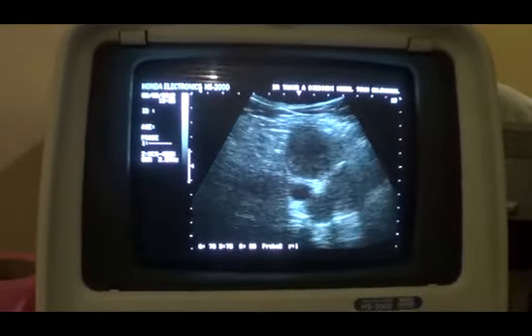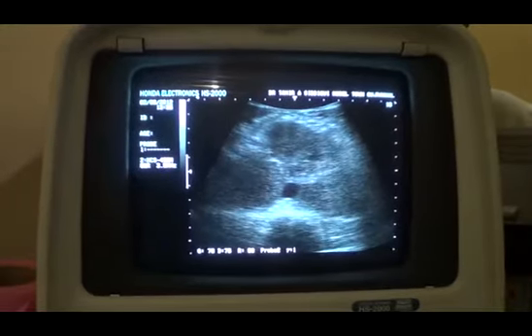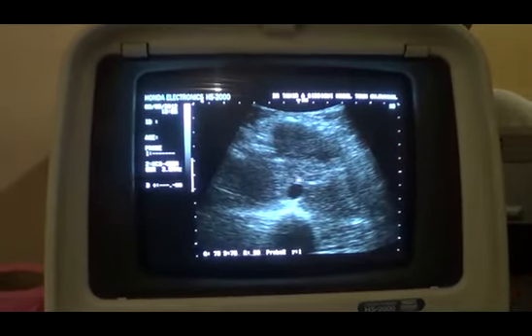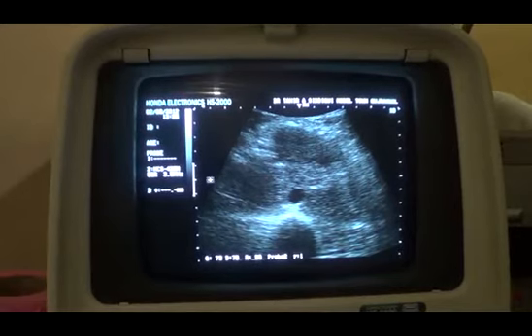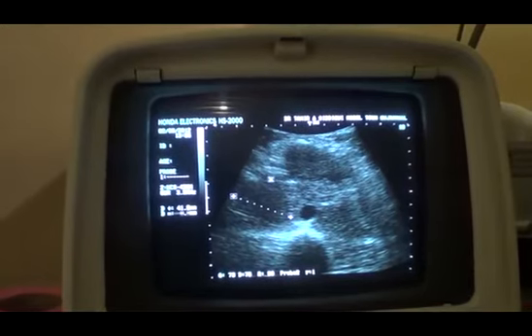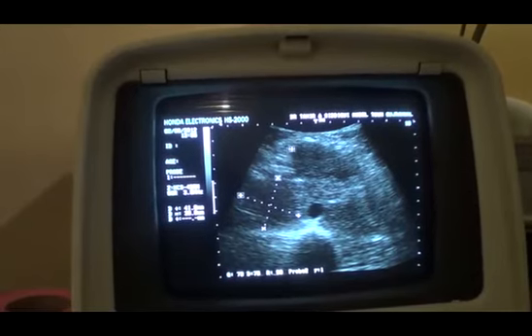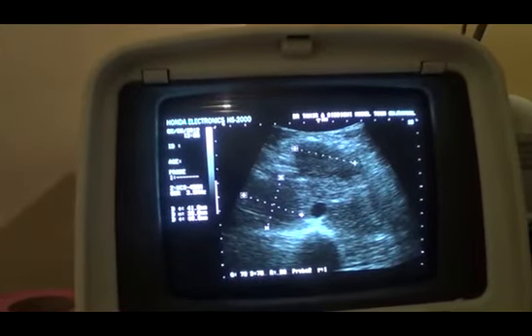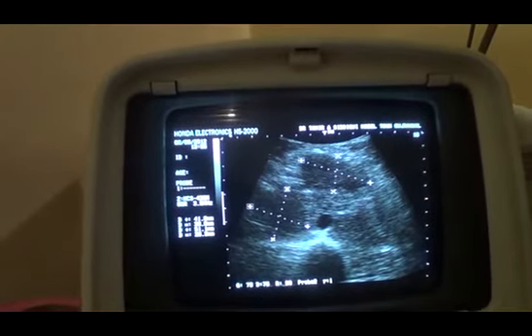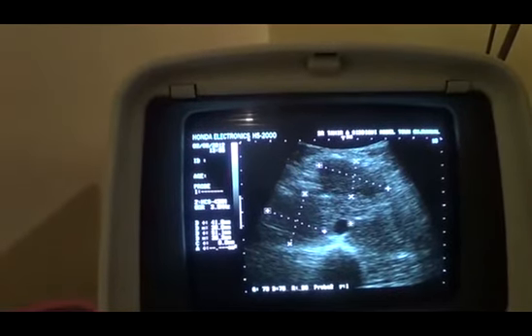Now when I go to the L4, L5 region, that is the umbilical region, here we are with three large hypoechoic focal lesions. These are solid hypoechoic, well demarcated focal lesions. Now this measures 41 by 38 millimeters. This anterior one, anterior to the aorta, measures 51 by 26 millimeters, and there is another one here.